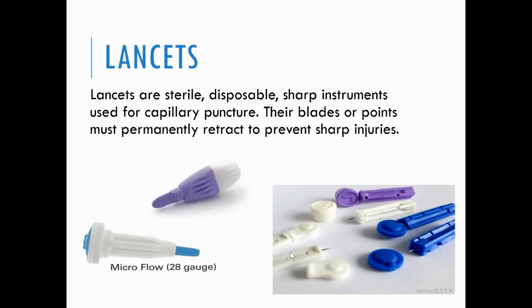So these are examples of our lancets. Na lancets nga kanaigo na lang nimo iduot kay magawas na lang ang dugo, kailangan ikan standardize ang pressure nga may apply pa kay nara po siya limitation. But kaning sa second picture kay kana ikaw jud makabuot kung saan mo siya pagduot, saan mo siya pagkuha, yan ang siya kadali. So that is why you'll be able to experience this soon.